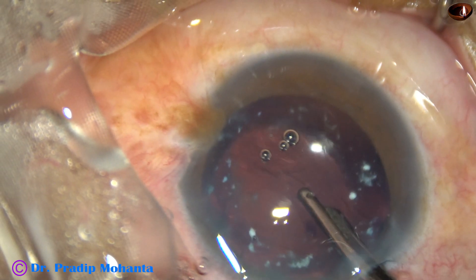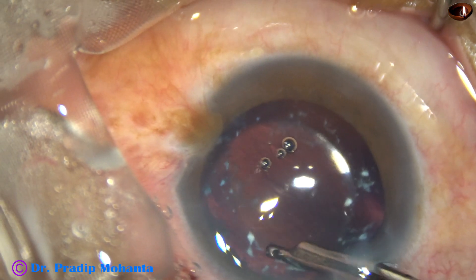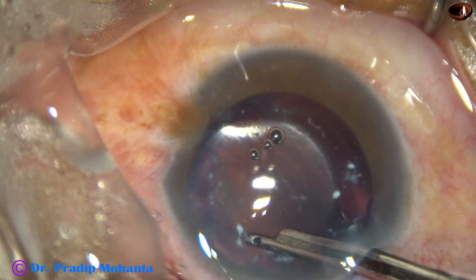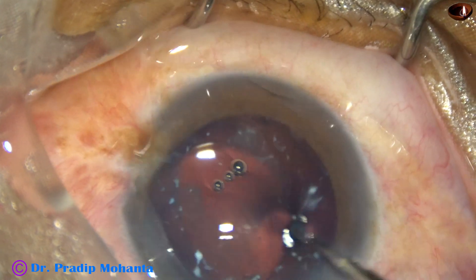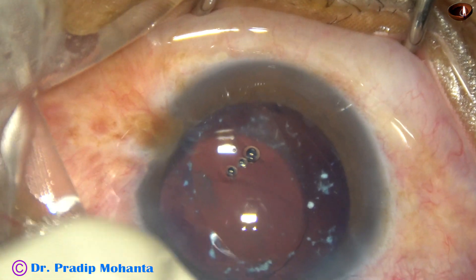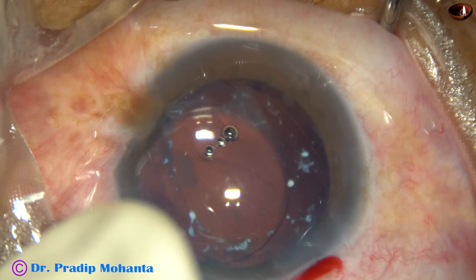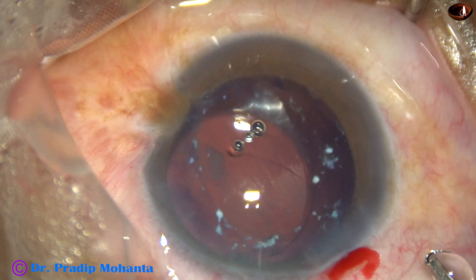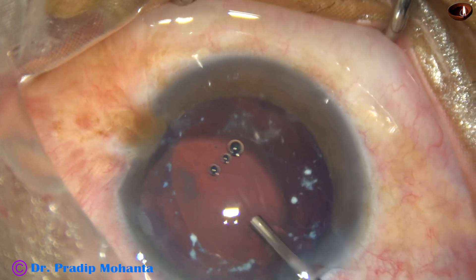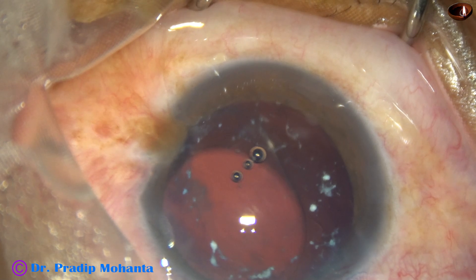This was done very thoroughly. In this case, I don't find any cortex anywhere. If there is cortex, we have to be very careful in aspirating it, because the zonule is very weak. Here, I find that the lens is decentered, so I have planned to put a CTR — capsular tension ring — and that will center the lens to a great extent.